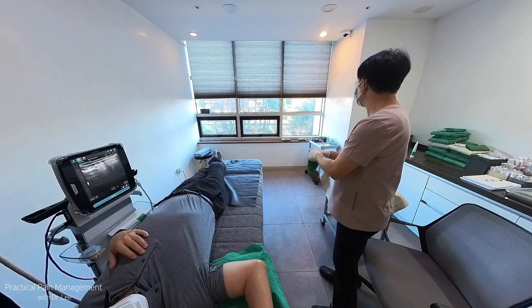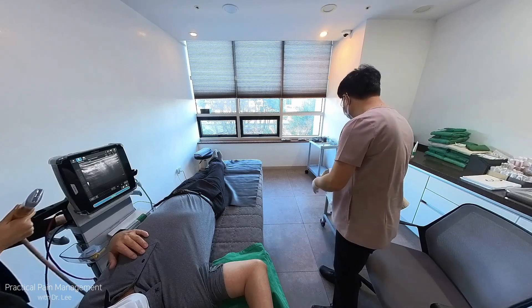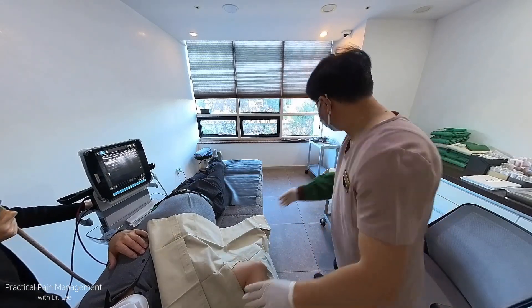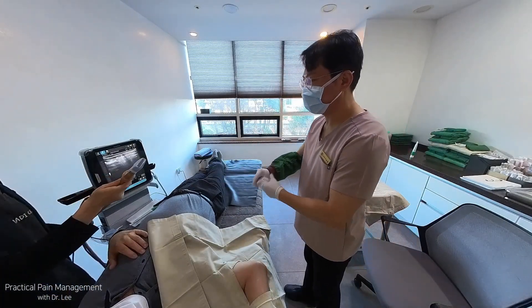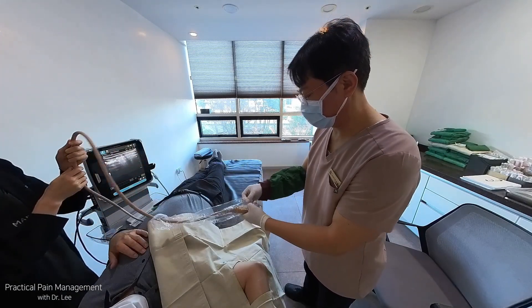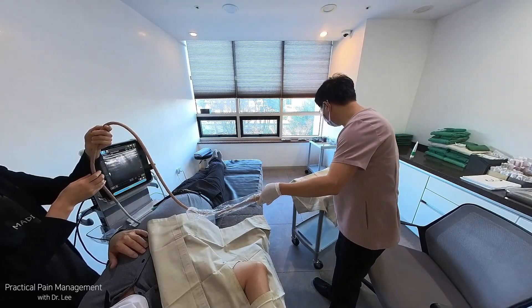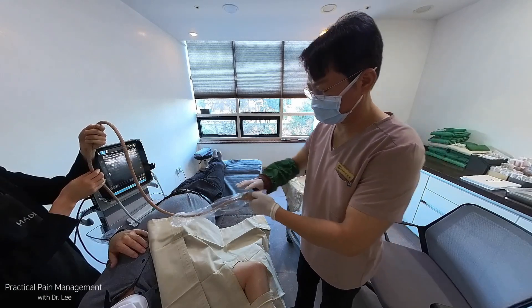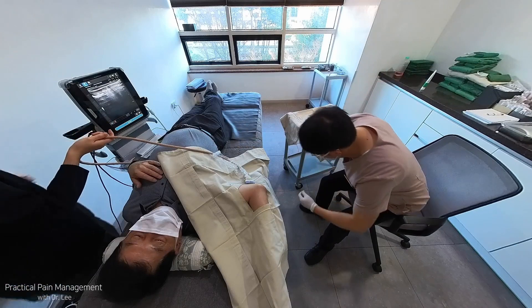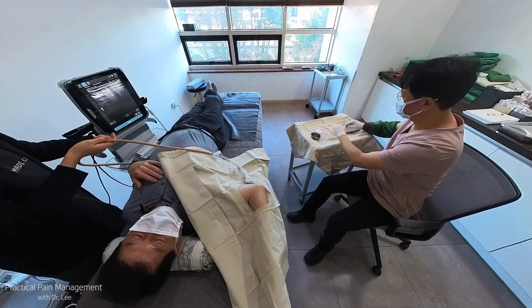Let me discuss the technical aspects of hydrodissection of the ulnar nerve in the cubital tunnel. Ulnar nerve hydrodissection is the second most awkward procedure in terms of target exposure. The first notorious structure is the trigger thumb release, especially in the left hand — the most challenging structure for ultrasound-guided A1 pulley release using the needle blade. First tip: take a comfortable patient position — supine with external rotation and 90 degrees shoulder abduction, with the affected arm supported and the elbow nearly 90 degrees flexed.